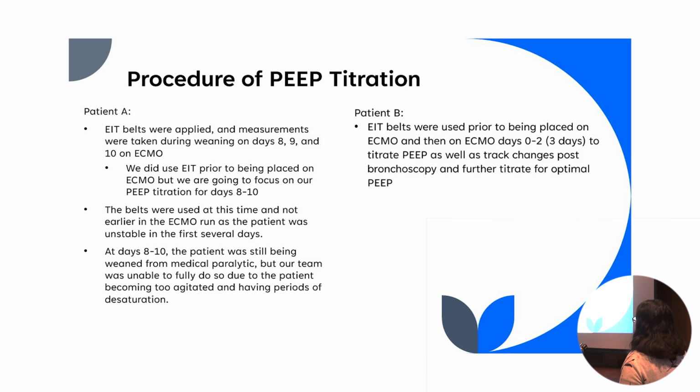Okay, so this is talking about what our procedure of PEEP titration was with each of these patients. Patient A had a little bit of a rougher go on ECMO, I'll say. If you'll remember, they were already, I think, 7 days of mechanical ventilation and ended up with 45 days of being on ECMO.